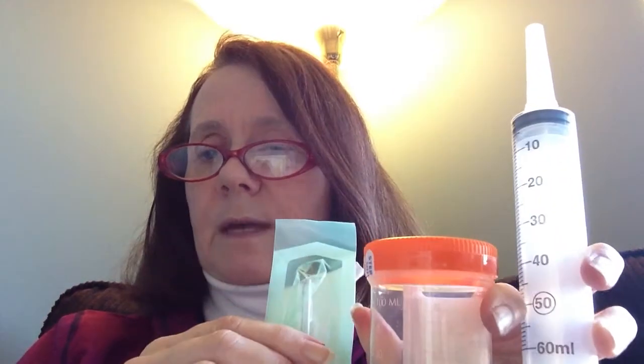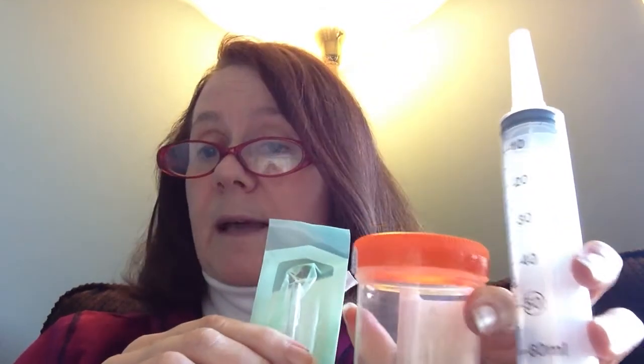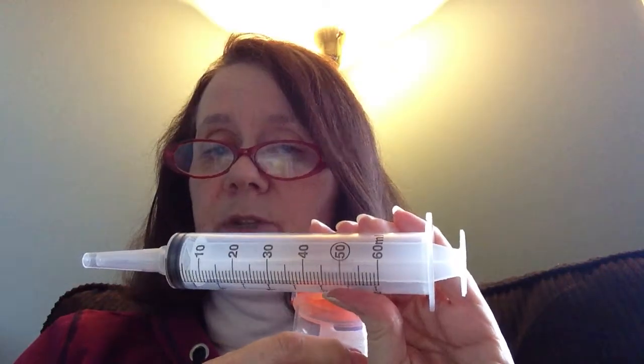I have bought all of these items by searching the internet for the best price possible. And if you're doing it on a regular basis, as I was, I needed to have a sufficient quantity on hand because I was doing them daily, basically. And I would order enough that I got free shipping. So the catheters, the sterile specimen cups, and the 60 milliliter syringes, none of those require a prescription, and you can shop for those online. Google them. This is Mentor catheter, so you can Google those.